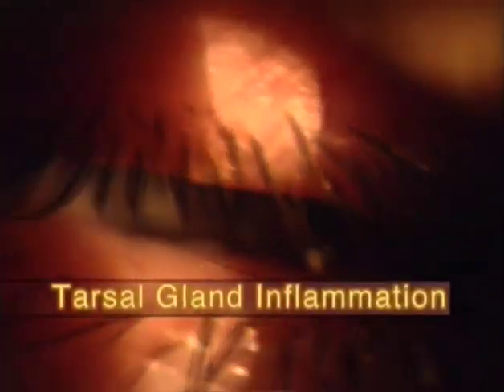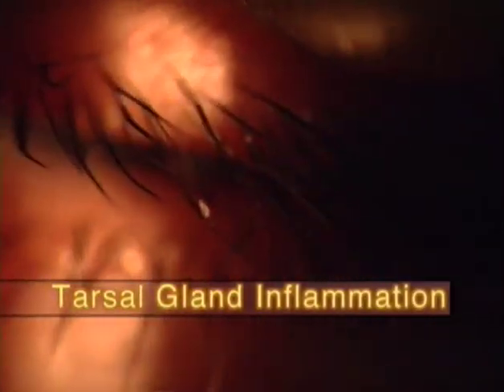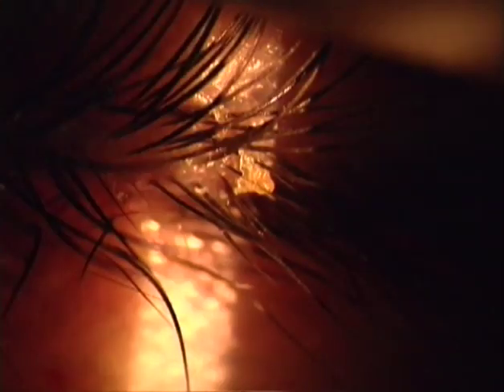In the next case, we see the major part of the lid margin to be clean, and the secretions to be confined only to a narrow area. This points to a local disease. And indeed, in the area concerned, we find an inflamed tarsal gland. This is the source of the secretions which have just been trapped in the ciliary row. There is no reason to suspect any disease of the ciliary glands themselves.